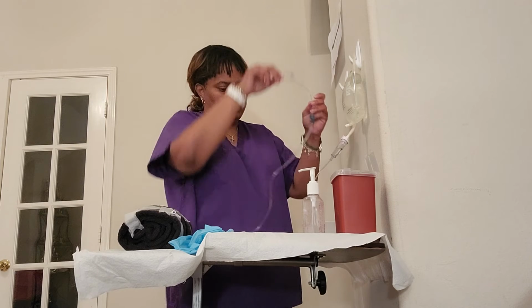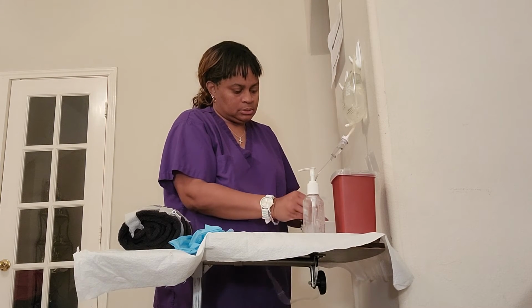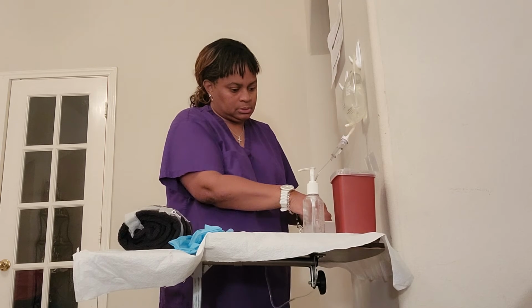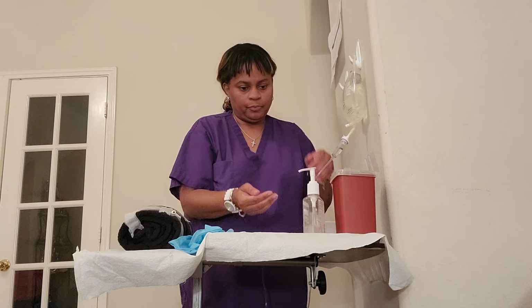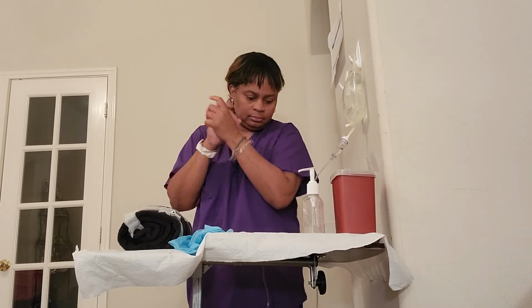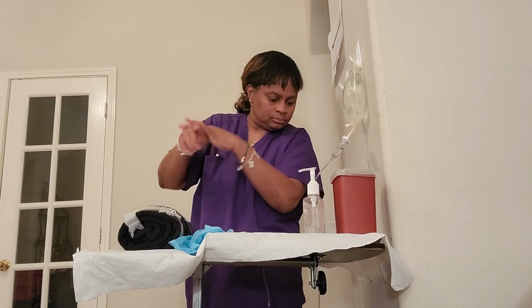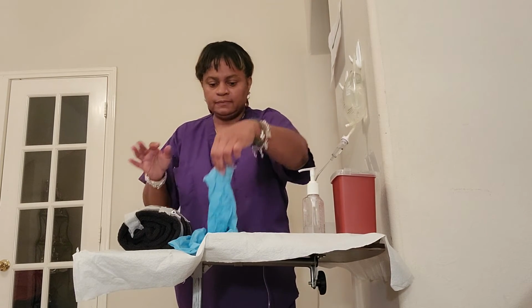I'm going to hang it right here where my receptacle is. And I'm going to perform my hand hygiene. I'm going to don my gloves.